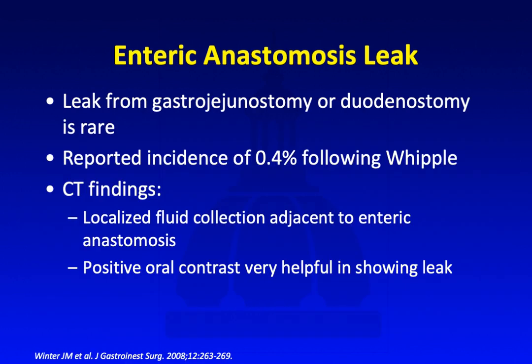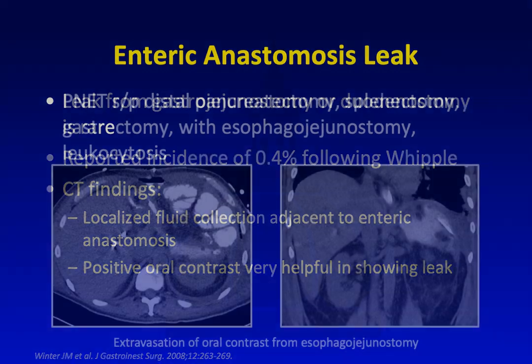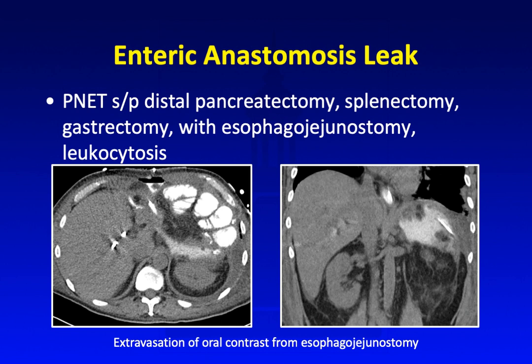Leak from the gastrojejunostomy or duodenojejunostomy is very rare — about 0.4% following a Whipple. CT findings again may show a localized fluid collection adjacent to the enteric anastomosis. Giving oral contrast makes the diagnosis much easier, as we would expect to see free extravasation of oral contrast material. In this patient with a PNET status post-extensive surgery including distal pancreatectomy, splenectomy, gastrectomy, and esophagojejunostomy — who was septic with a high white count — oral contrast made it through the small bowel, but an irregular contrast collection in the left upper quadrant revealed breakdown at the esophagojejunostomy.